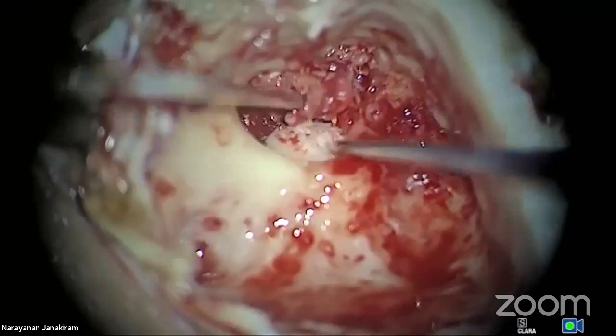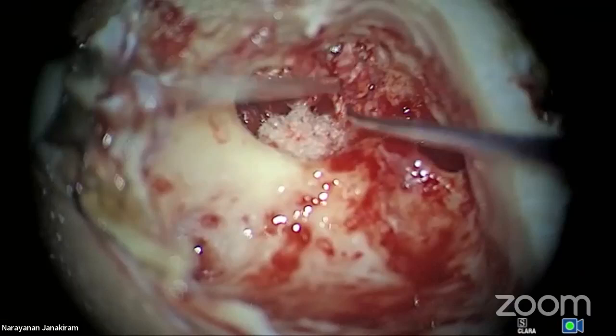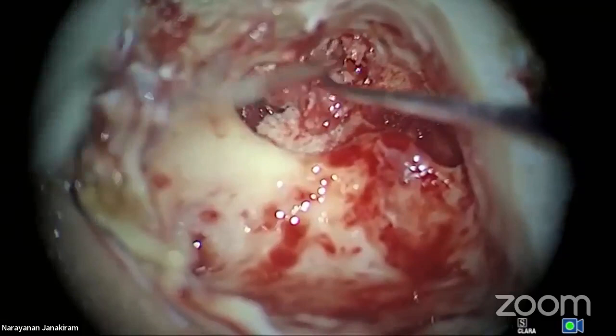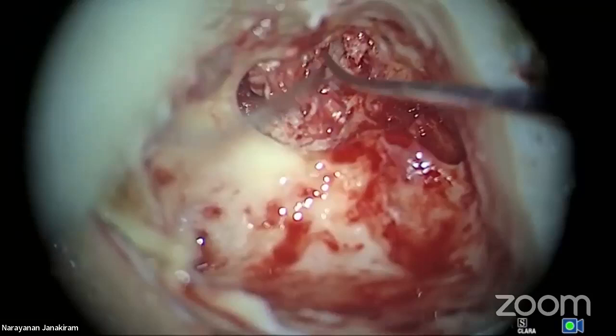Now, what I'm going to do is use the scissors. You can see the handle of malleus, which we saw in the CT. Can you see the process cochleariformis, my dear friends? Yes or no? See, such an extensive cholesteatoma. And now I'm going to go anterior to see what? The eustachian tube. See that?